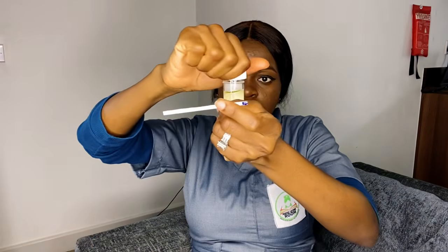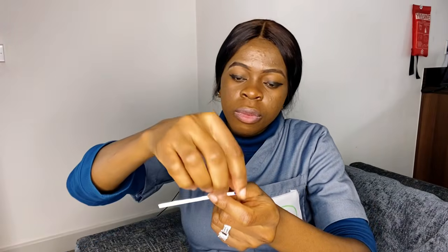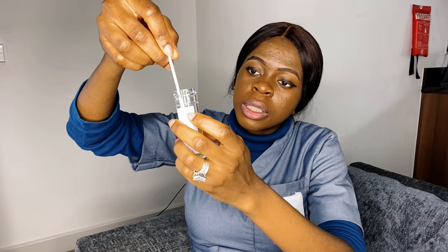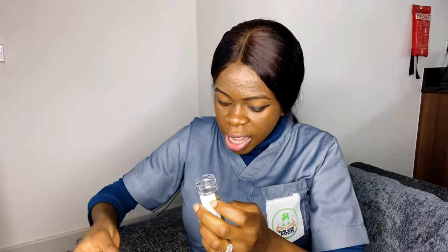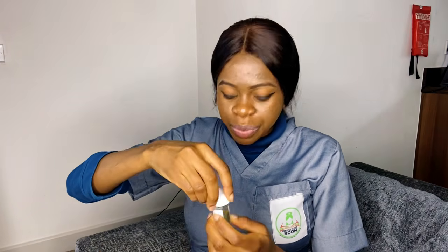So this is the first sample. Okay, I'll just put it on top of this cap. This is the first sample. Hope we can see it. Open. Then I'll put it inside. I'll dip it inside, up to the marks. Remove it and keep it. It's on top. We'll be waiting.